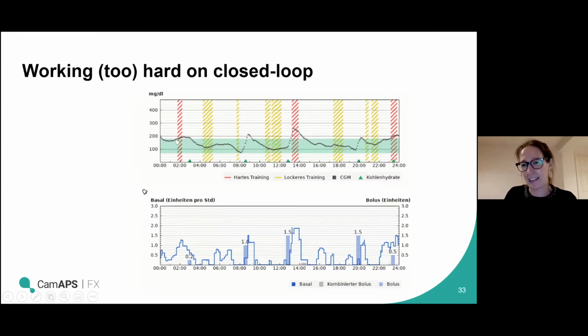The things that particularly worry me are overnight interactions with the app. This is the easiest time for closed loop to manage glucose. If this is you, and we've all got a tendency to want to do something sometimes, it's worth bearing in mind whether that's essential to do at that time, or whether I can just trust the system to do its job and, as Sarah says, improve quality of life and reduce burden.